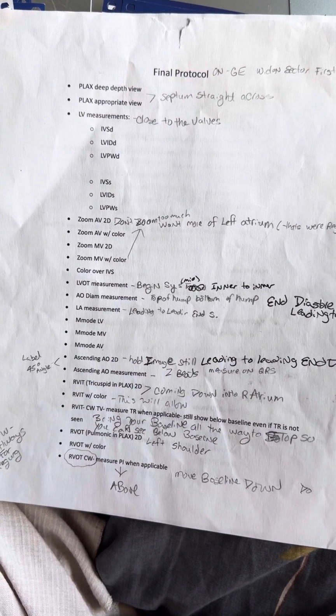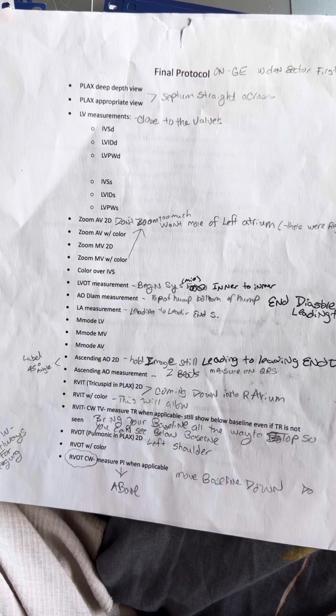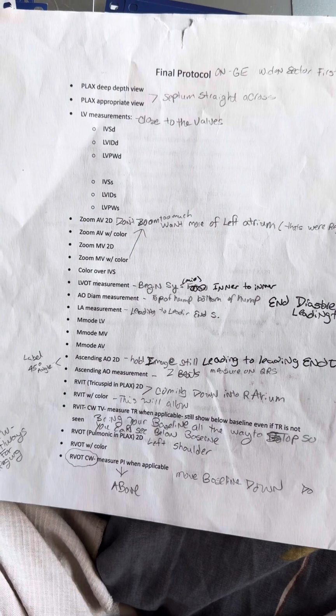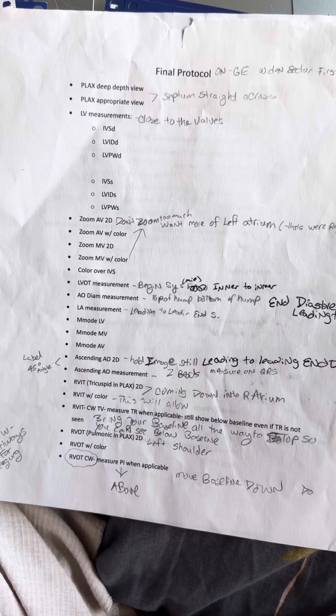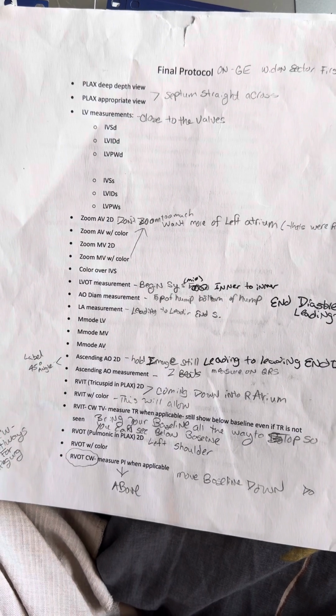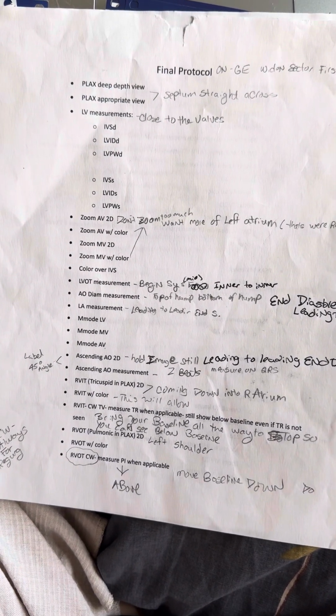Next, zoom your mitral valve, 2D. Zoom mitral valve with color. Do your mitral valve in M mode.